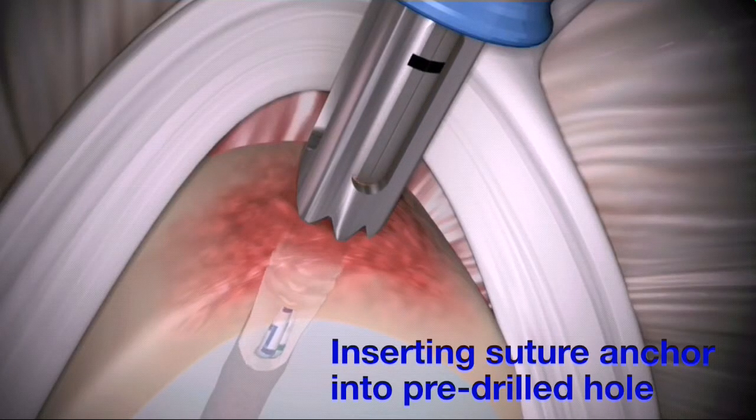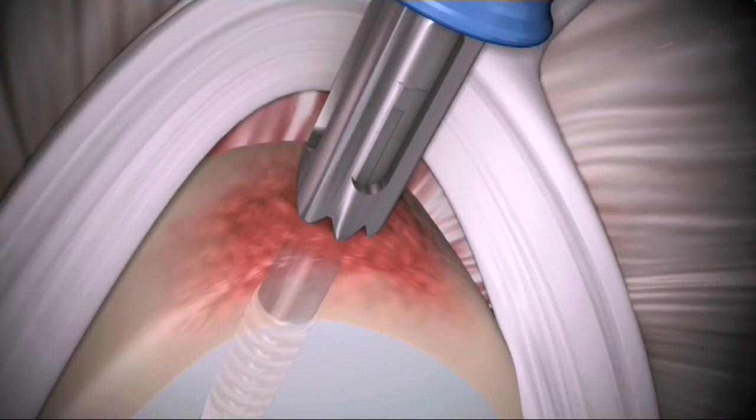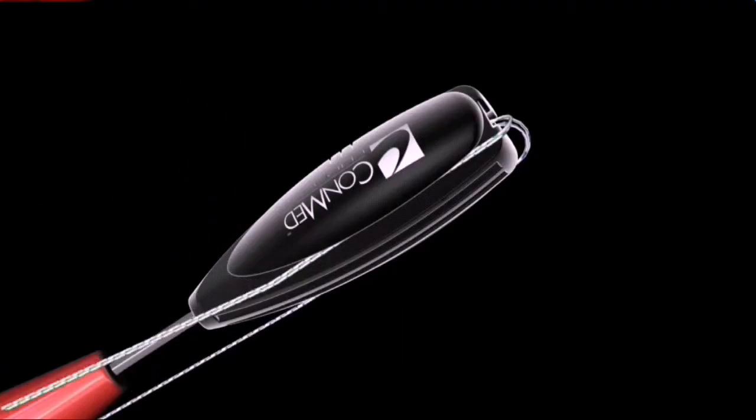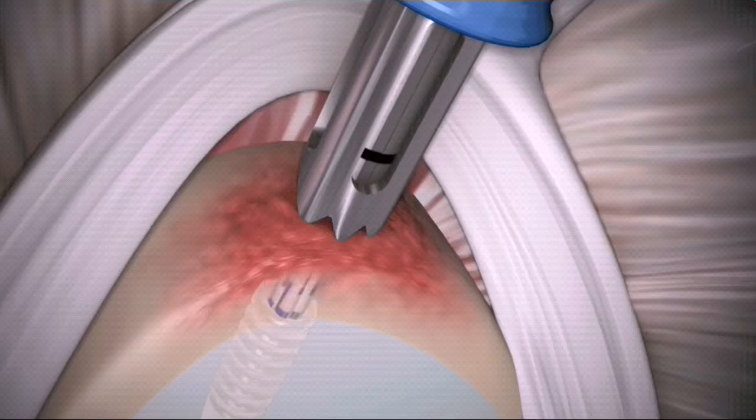Use a mallet to advance the implant until the distal depth mark on the driver is below the surface of the bone. Release the suture from the driver cleats and remove the driver and drill guide from the joint.